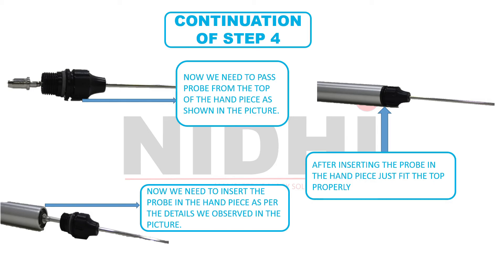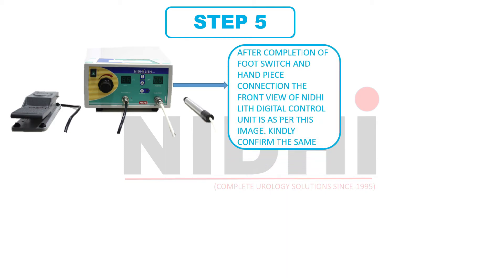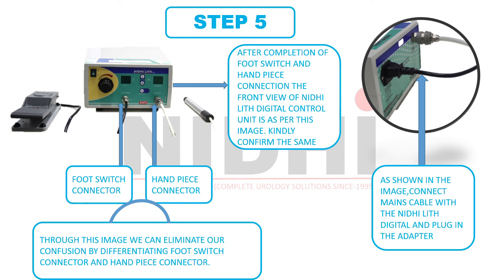This image shows the perfect connection of handpiece and prop. Now this is the last and final step of our installation process. As we can see in this image, this is the front view of the NeedyLit Digital Control Unit after the successful connection of footswitch and handpiece. If you have any confusion between the footswitch connector and handpiece connector, here we are differentiating them: this is the footswitch connector and this is the handpiece connector. Now we need to go to the back side of the NeedyLit Digital Control Unit. Just connect the mains cable with the NeedyLit Digital Control Unit and plug in the adapter. We have completed the entire installation process of NeedyLit Digital. Thank you so much for watching.